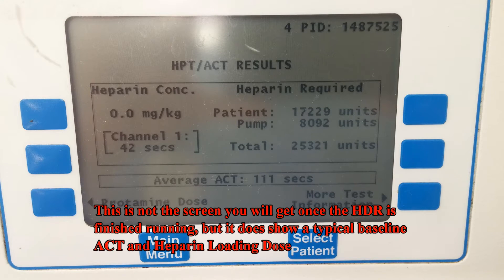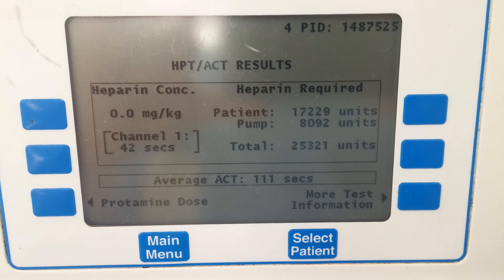The HDR cartridge has six wells: two with no heparin, two with 1.5 units of heparin per milliliter, and two with 2.5 units of heparin per milliliter. By running an ACT on each set of wells, the machine is able to calculate a relationship between the heparin concentration and the ACT. The machine can then generate a target heparin concentration by extrapolating the point at which the concentration would result in an ACT of 480 seconds. The machine will also display the baseline ACT based on the two wells without any heparin, as well as the calculated heparin dose for the patient.